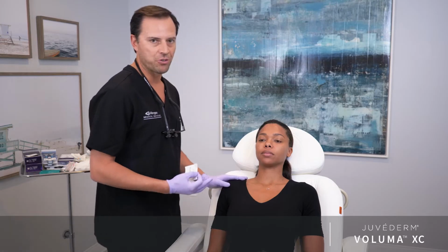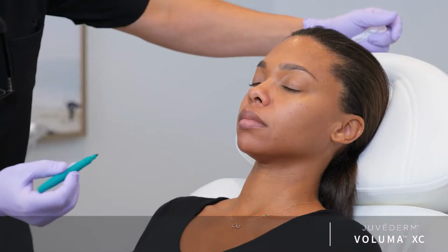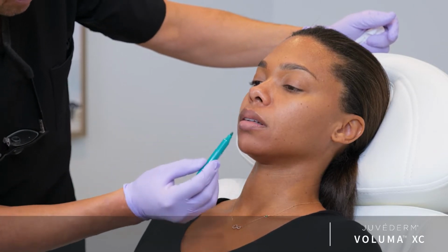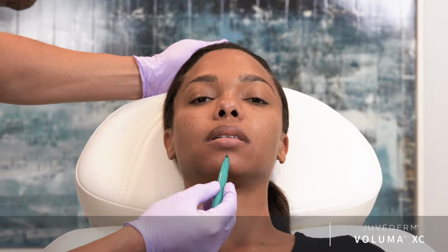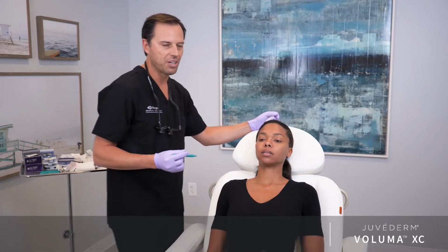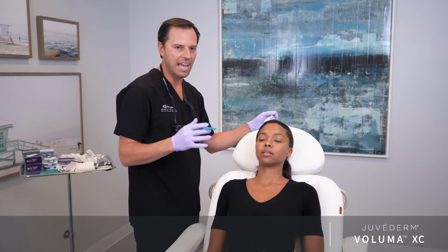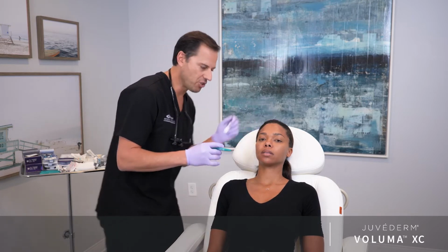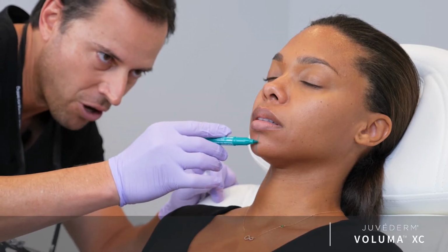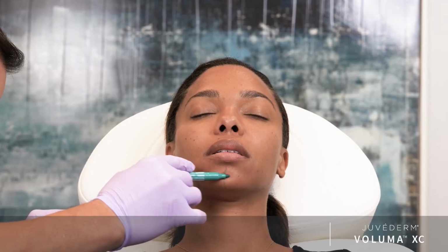Now we'll proceed with the treatment of Talisha's chin. Talisha, do me a favor and open your mouth just a little bit. I see where the teeth are, I see where the columella is. This is the midline right here. And now what I want to do is mark out the pogonion, which is the most anterior projecting aspect of the soft tissue. In order to do that, I assess from the profile, and the pogonion is right about here.